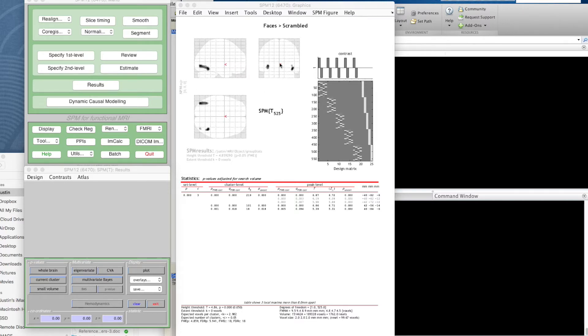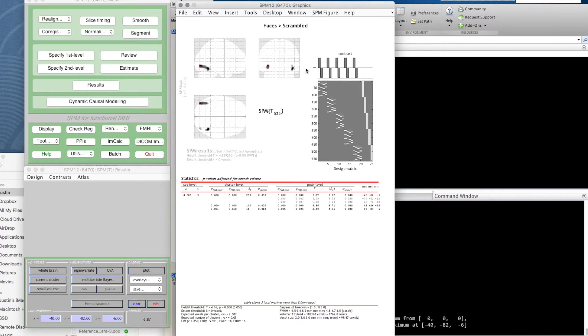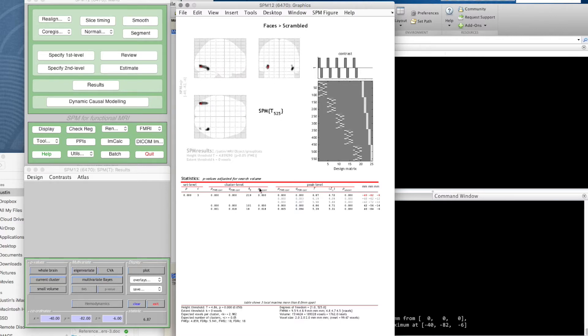We've got some summaries here—there's coordinates here of where this little red pointer is. If I right-click, I get some options. I can go to global maximum, and this will jump the pointer to the voxel which has the highest t statistic.